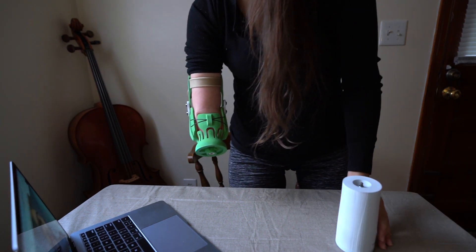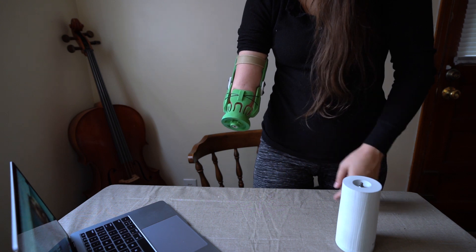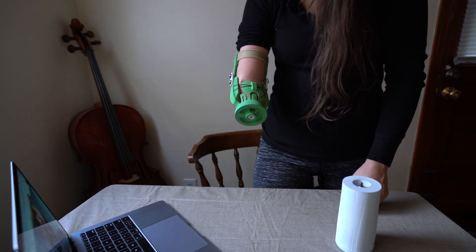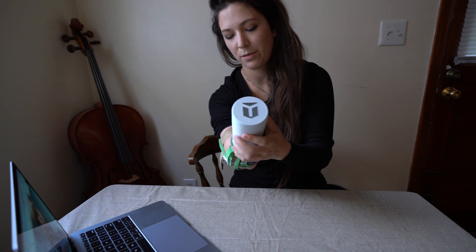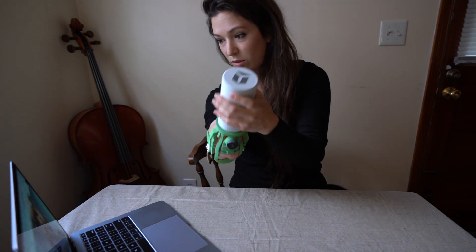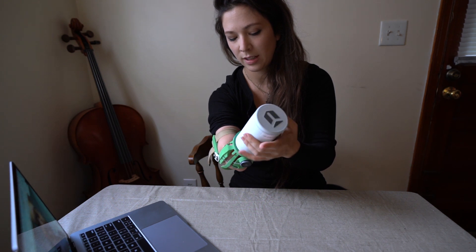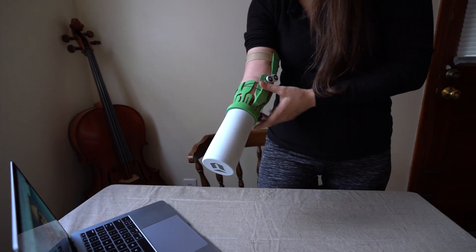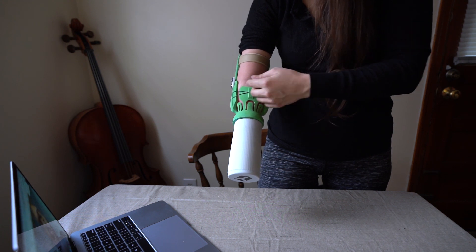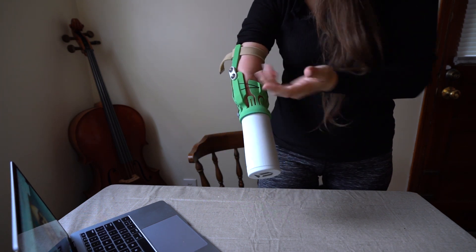The clinician notes the green one is the tallest of the set and asks how she likes that taller portion. Abby says she likes it a lot — she thinks that's what makes it feel more secure. It goes slightly into her elbow crease but not in an annoying way. She reflects on years of viewer suggestions about screw-on attachments — toothbrush, drumstick, machine gun — and now that it's real, it's exciting. The main weight-bearing control area is just below her elbow.